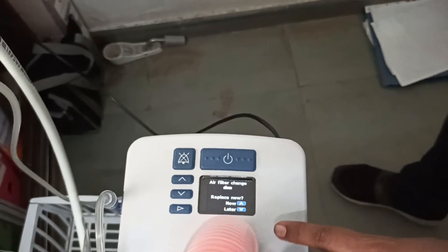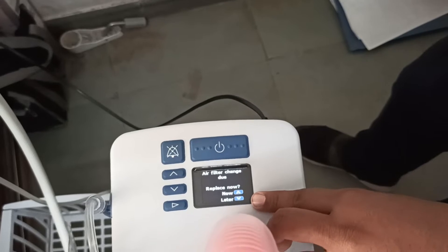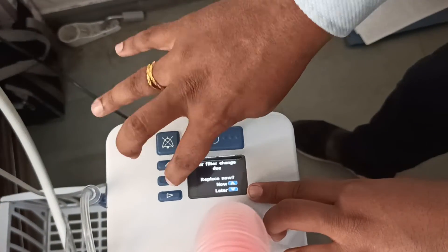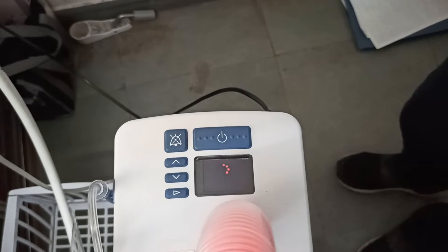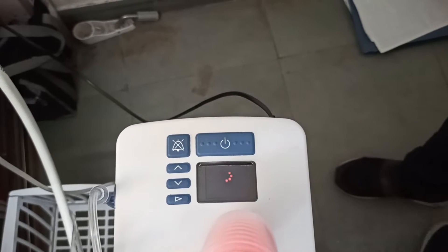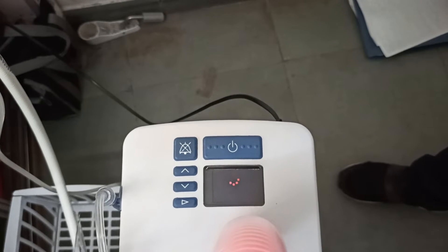Now we are not going to change the filter right now, so for 'replace now or later' we will go for later. Press this arrow — and now automatically the machine will go into disinfection mode.